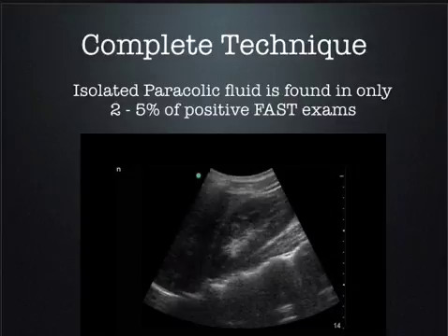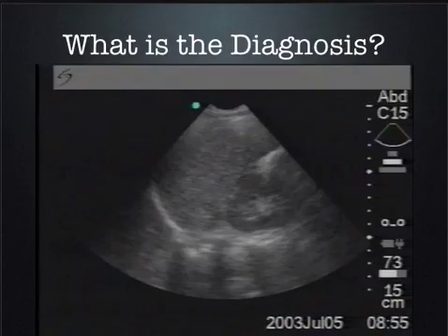So, because young, healthy ladies, like I told you, can tolerate loss of blood, and they don't lose their vital signs, they come in with abdominal pain, and the nurse takes their blood pressure, and it's 80/40, and they go, oh, this is bad. And so they rush them back to a C room, and they lay them down, and you catch it at the inferior pole because it's migrating up, and it turns out that they've got a ruptured ectopic pregnancy. That's what that one was.